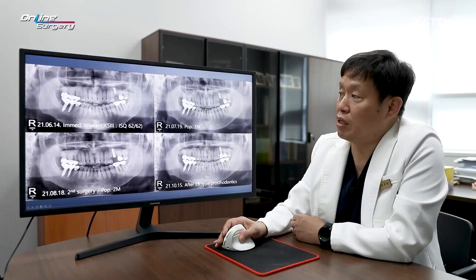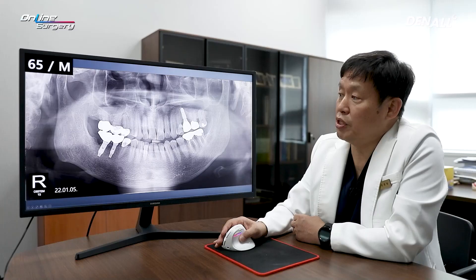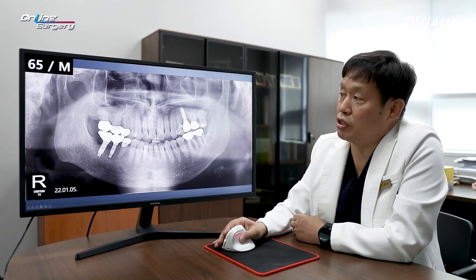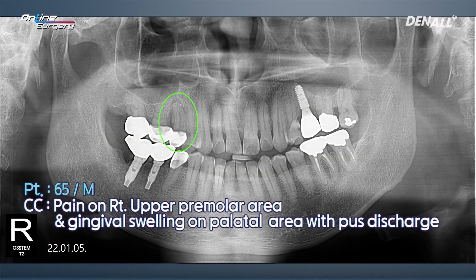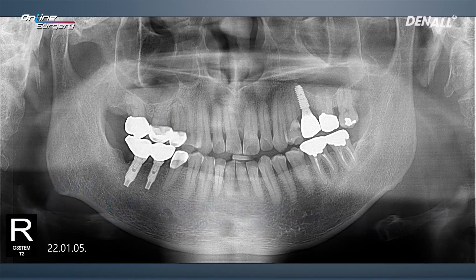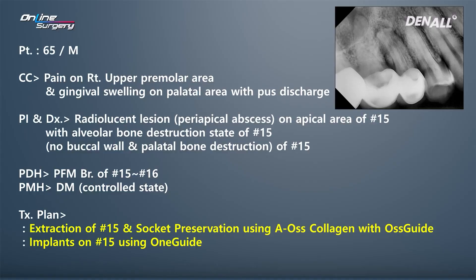In January 2022, the patient came in complaining of the upper right premolar area, number 15. There was gingival swelling and pus. The two teeth were connected as a bridge. If you take a closer look at the periapical image, there was a periapical abscess.